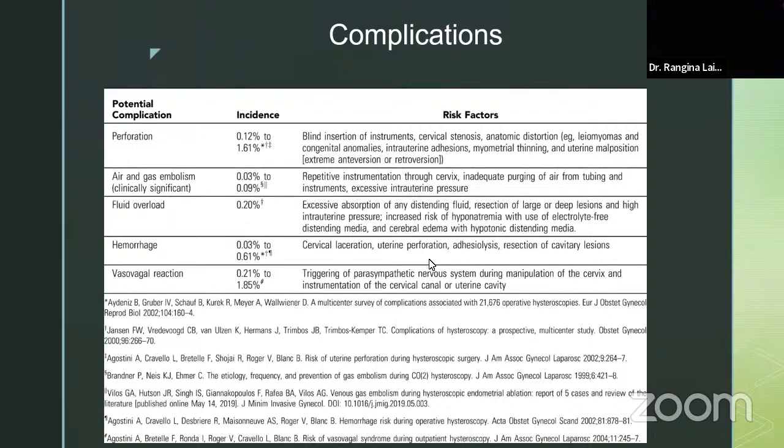So, complications. Yes, I would really like to include air or gas embolism, because at one of my conferences, one of the doctors presented that she has done more than 1,000 cases of hysteroscopy in her life, but it was a single case which taught her everything about air embolism. So it is very important to teach the OT room staff that when the fluid is about to run out and you are going to change to another bottle, they should not pass air while doing the procedure.